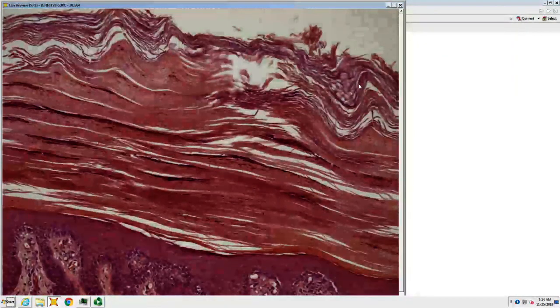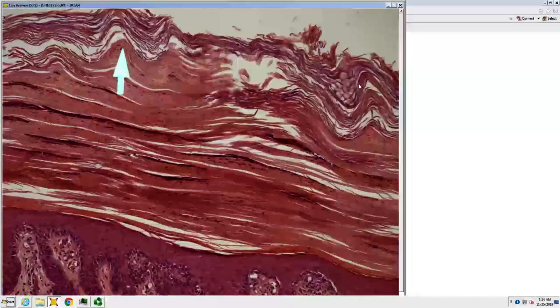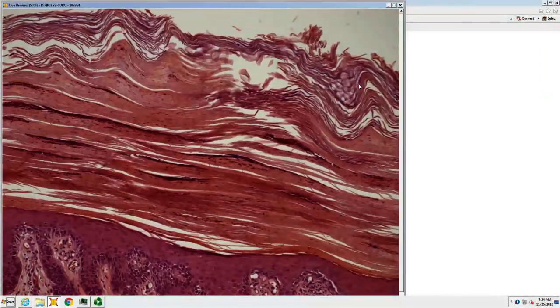There's parakeratosis. And neutrophils, I think. They're kind of alternating. So like neutrophils on top of para, on top of neutrophils, on top of para, on top of neutrophils, on top of para. Psoriasis. Very good.